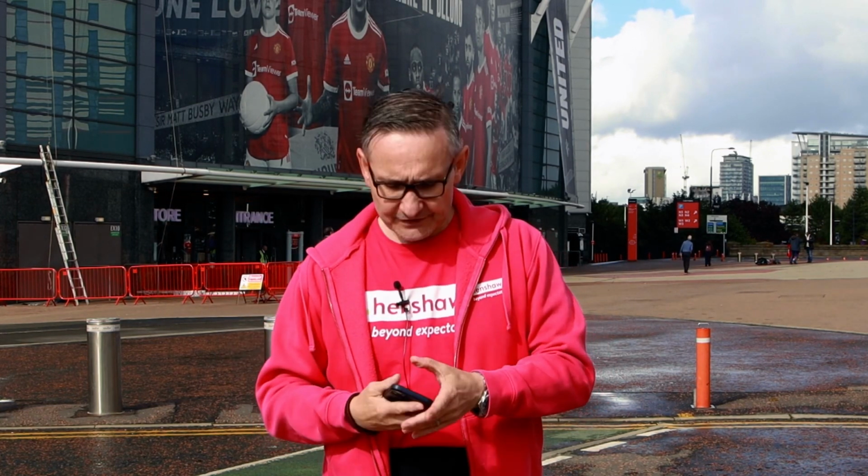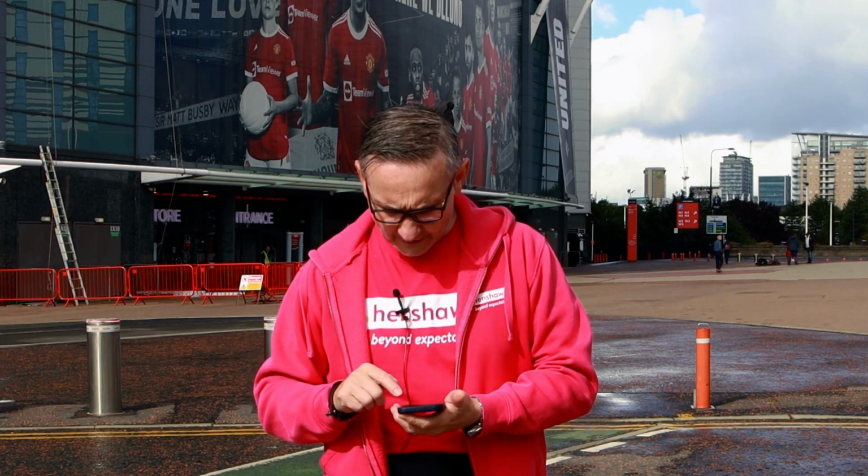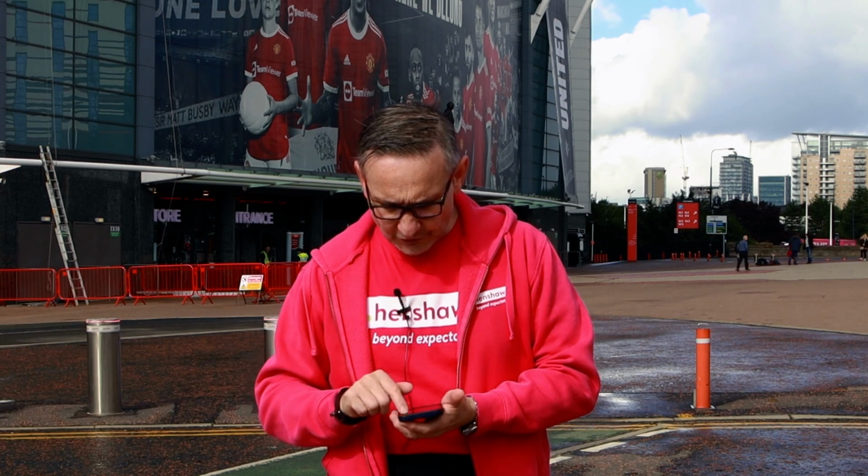There's another feature on this called Beeline. So it just literally points you to the direction. It doesn't tell you left and right and all that jazz. It's just like line of sight. Or as the crow flies, some people say. So I'm going to just punch in Tesco. And then we're going to do that.